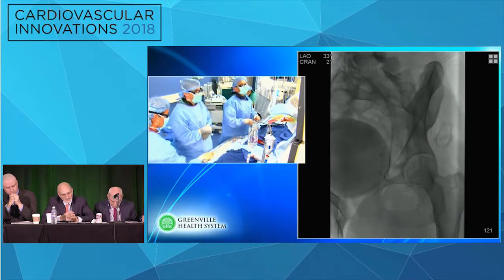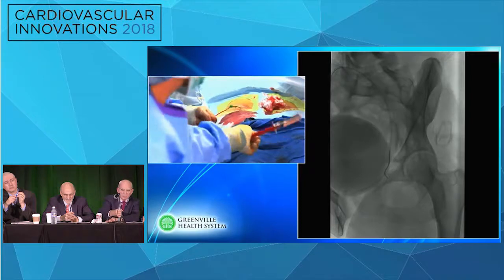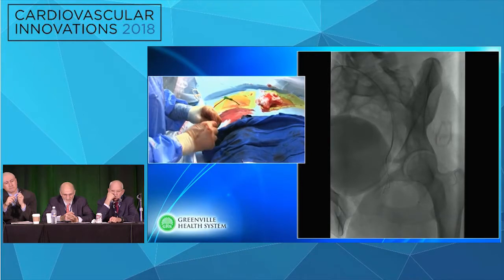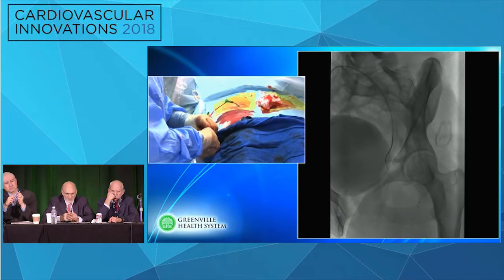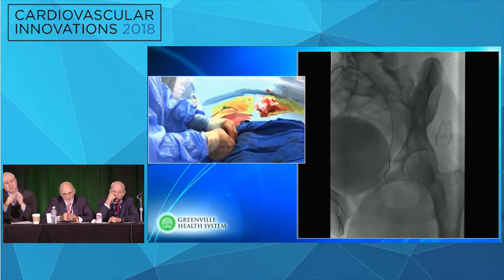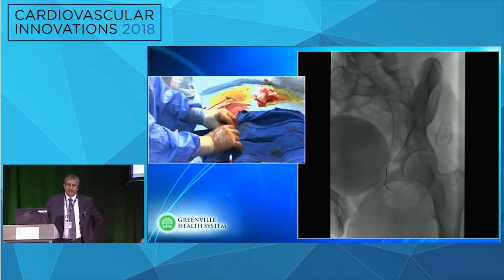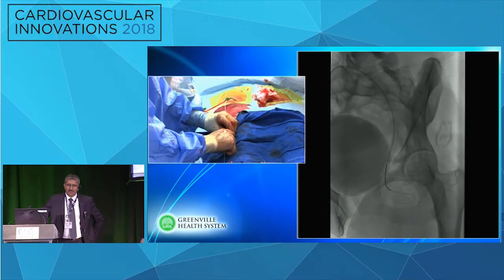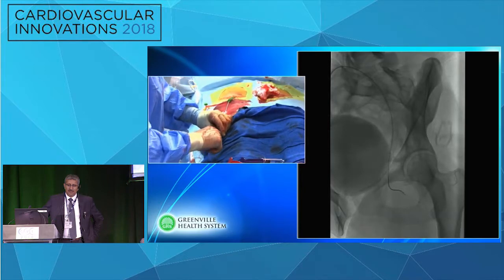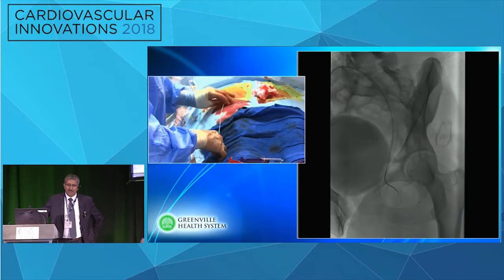I'm just not comfortable making a decision yet as to where to put it, but I don't want it too low, and the thought of cleaning out this groin, we've done that, and it's like yellow grizzle that comes out of there, and our results haven't been very good with cleaning out the chronic clot. That is the saphenous. And I like to use the lesser trochanter as a frame of reference, but it's got to be over there, right there someplace. Let's just get a catheter down a little lower, see if we can see something down there. Got to be, that's too lateral. Promising.